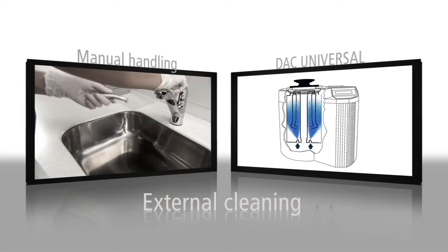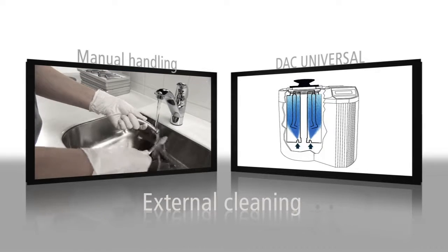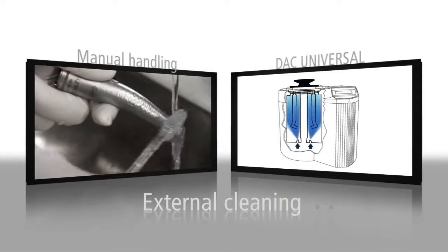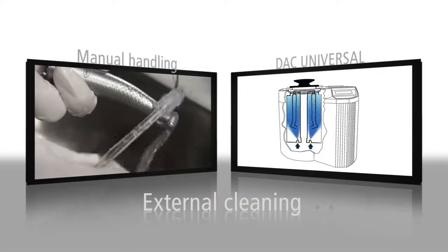In order to remove blood from the outside of the instruments, the DAC Universal's external cleaning procedure starts with a cold wash immediately followed by a hot wash to safely remove possible biofilm like saliva and cement.